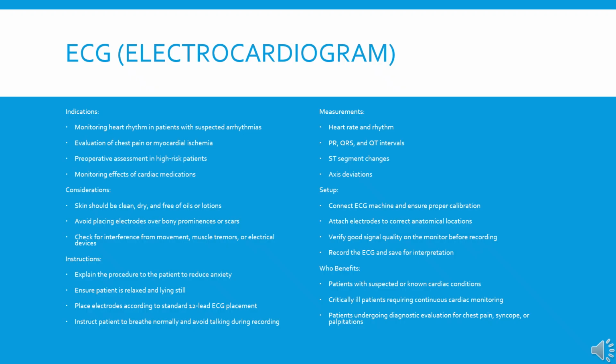And then the setup is connect ECG machine and ensure proper calibration, attach electrodes to correct anatomical locations, and verify good signal quality on the monitor before recording. And who benefits are patients with suspected or known cardiac conditions, critically ill patients requiring continuous cardiac monitoring, or patients undergoing diagnostic evaluation for chest pain, syncope, or palpitations.